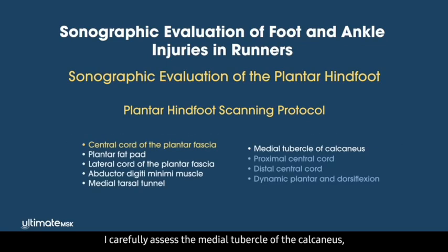I carefully assessed the medial tubercle of the calcaneus, the proximal and distal portions of the central cord of the plantar fascia, and performed dynamic plantar and dorsiflexion of the foot to place tension on the central cord for tears.